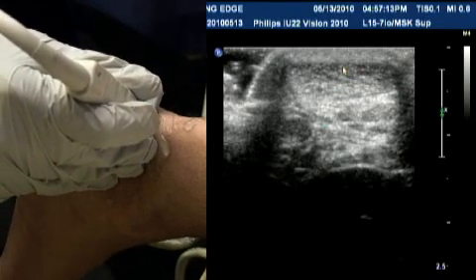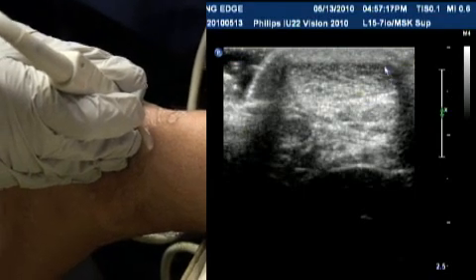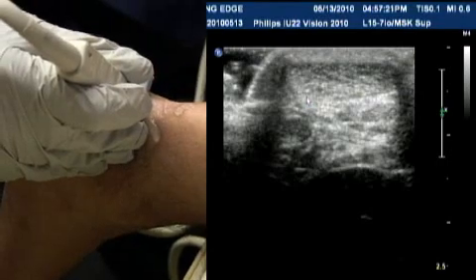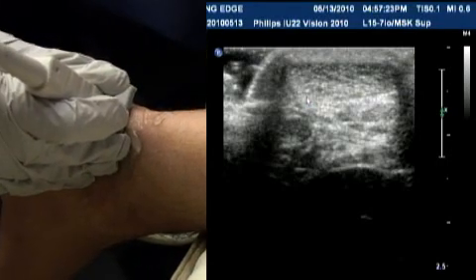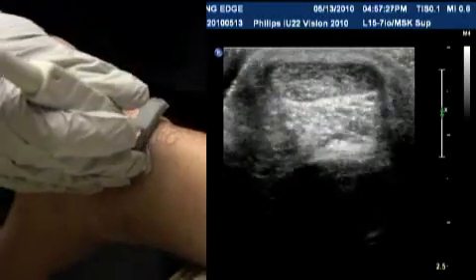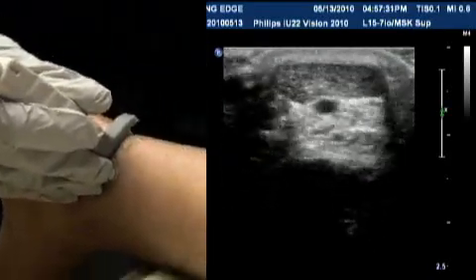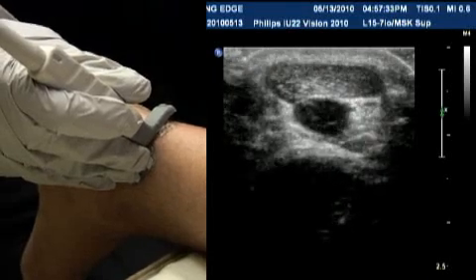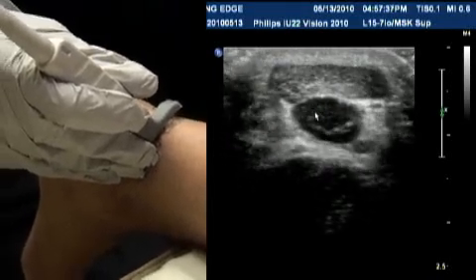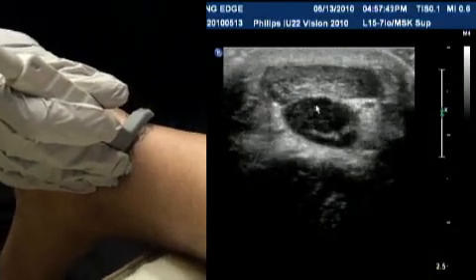The first thing that happens when the tendon becomes abnormal, apart from a tear, if it's inflammation, is that the tendon becomes more round. That's a subtle change that you can catch when you are looking at tendon pathology like inflammation or tendinitis. So here's a normal tendon. You're going to be scanning up and down, going proximal, or more towards the head, and what you see appearing below is just the muscle belly. That's normal. Muscles always appear a little bit darker than the tendon, and you can see that difference between the tendon and the muscle.